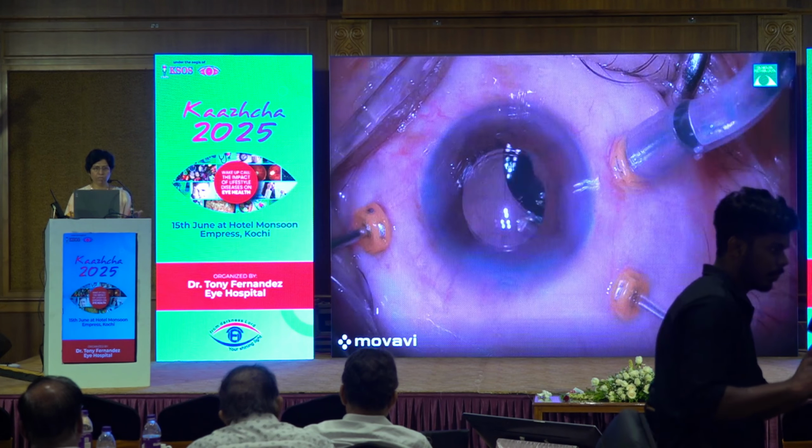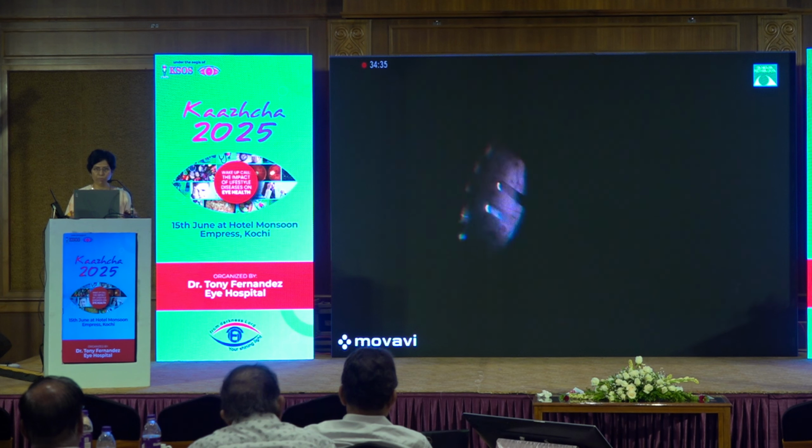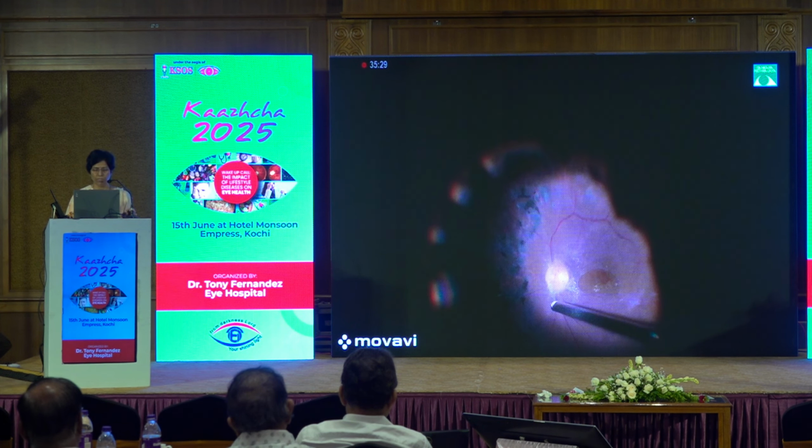Such as in this case, where you have probably only vitreous hemorrhage or only a few membranes, where you do not expect much manipulation and do not expect to put silicone oil, etc. You can go ahead and do cataract surgery combined with this.